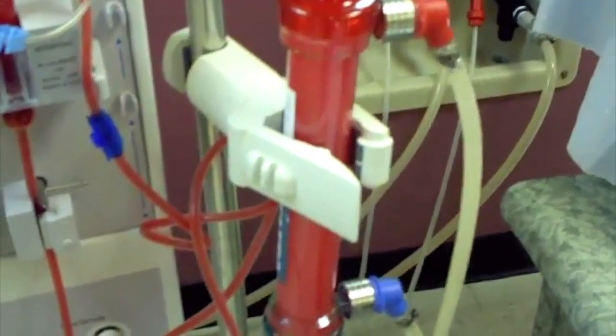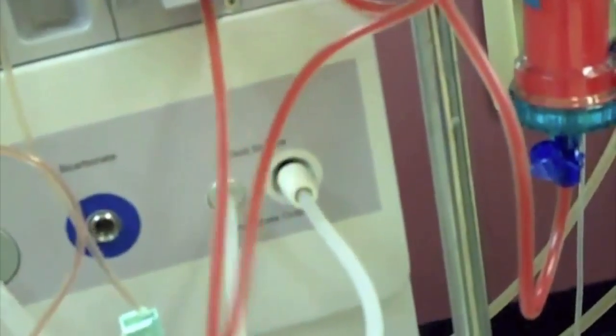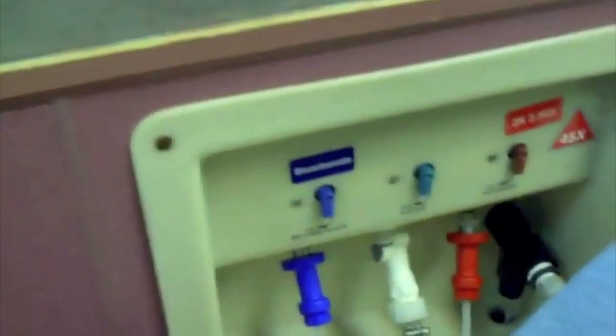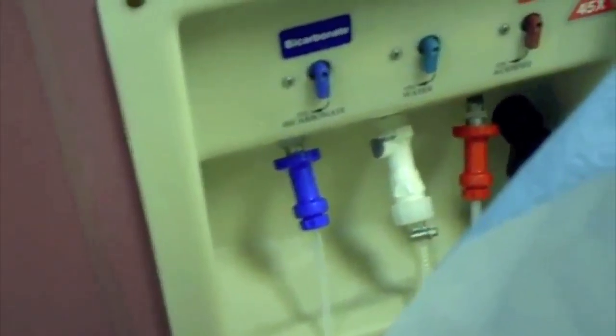But let's say that the machine has a ureter too. I will show you where it is. This is the ureter. That's where all the toxins and the waste product are collected, and that's where it gets funneled before it gets excreted out in the back of the machine. That's where the drain is, right there. And that should be the urethra.